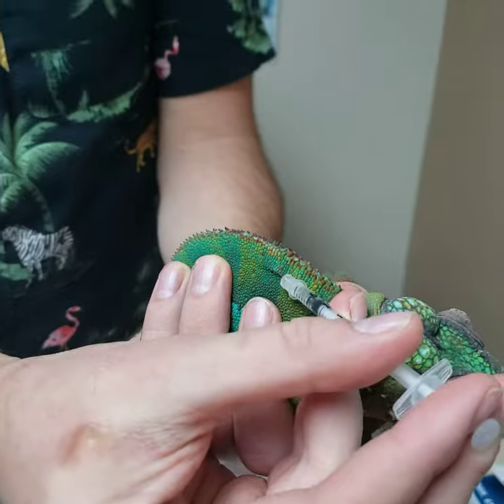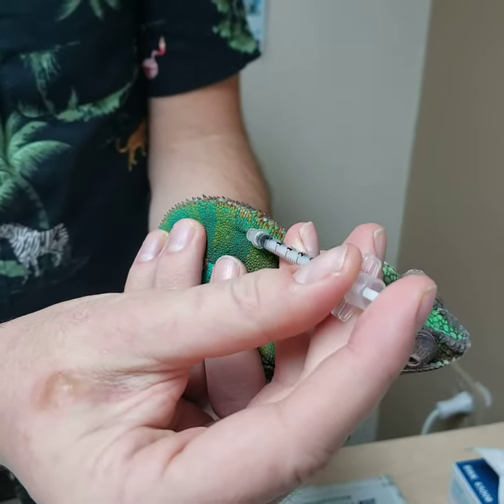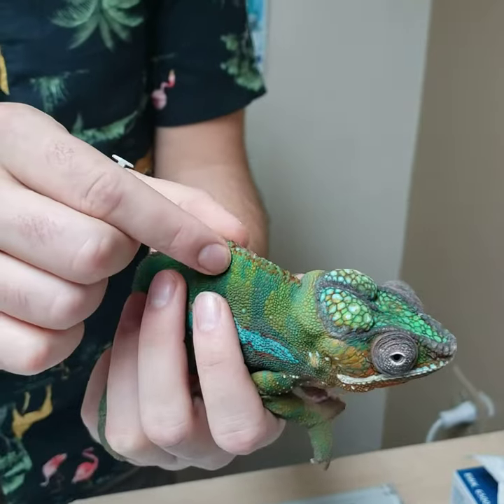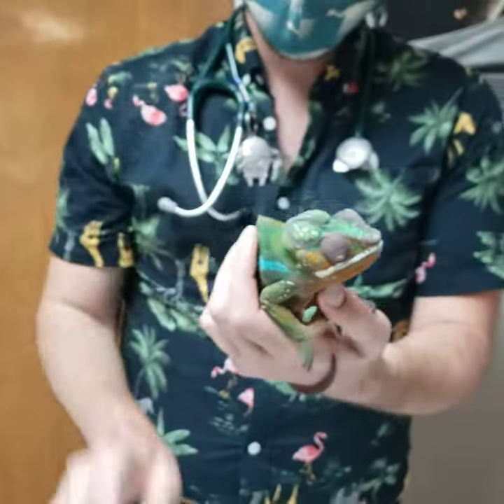So it's in, I draw back, it goes back in nicely, and I inject. He wasn't a huge fan. We kind of massage it in. So that is our injection.